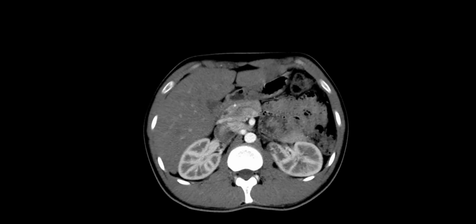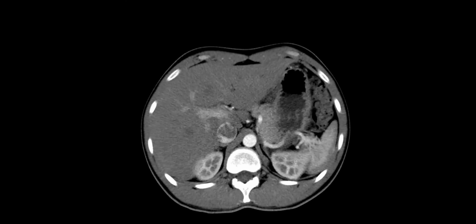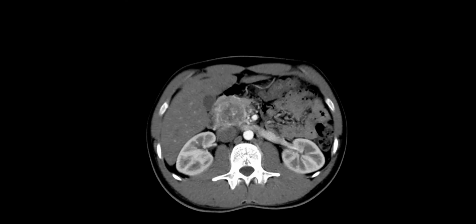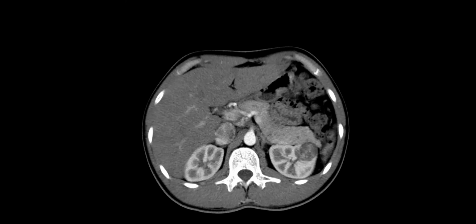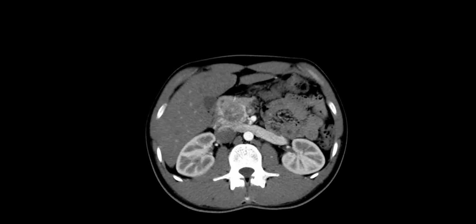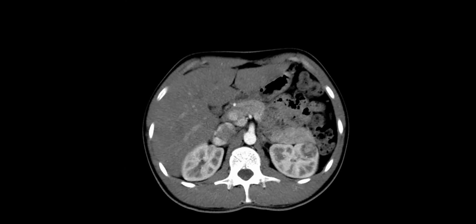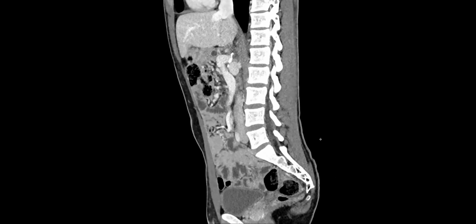Yes, so this was a neuroendocrine tumor, bilateral RCCs. It does look fatty, but all of these underwent partial nephrectomies and they came back clear cell. So I don't know if it's intralesional fat and it just looks more hypodense, making it look like macroscopic fat, but they were all clear cell RCC. And then I think I showed the spine, but I think the hypodensity is actually the VHL clear cell RCCs tend to have a lot of T2 hyperintense fluid in them.